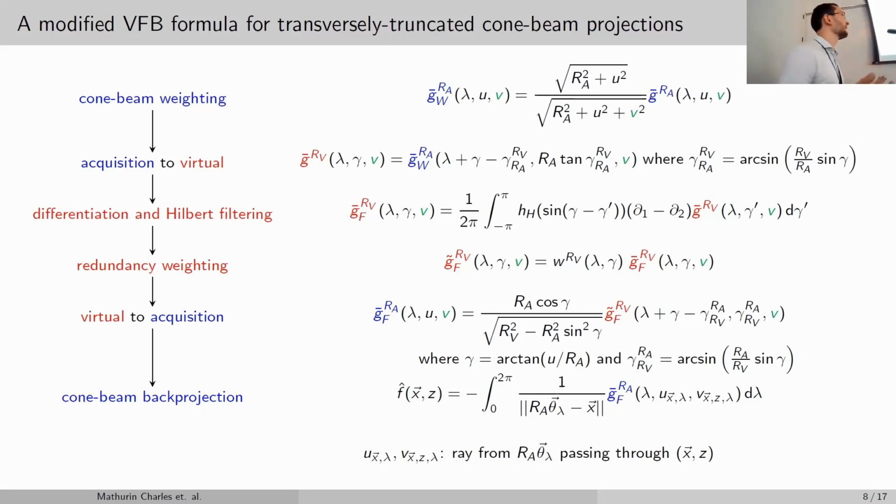Of course, you don't have to go back to the original geometry. You have your XY position of the ray because it's a 2D method, and then you know where it intersects the acquisition trajectory, and then you could basically deduce the direction in the Z direction, the tilt angle of the ray, and back project along this way.